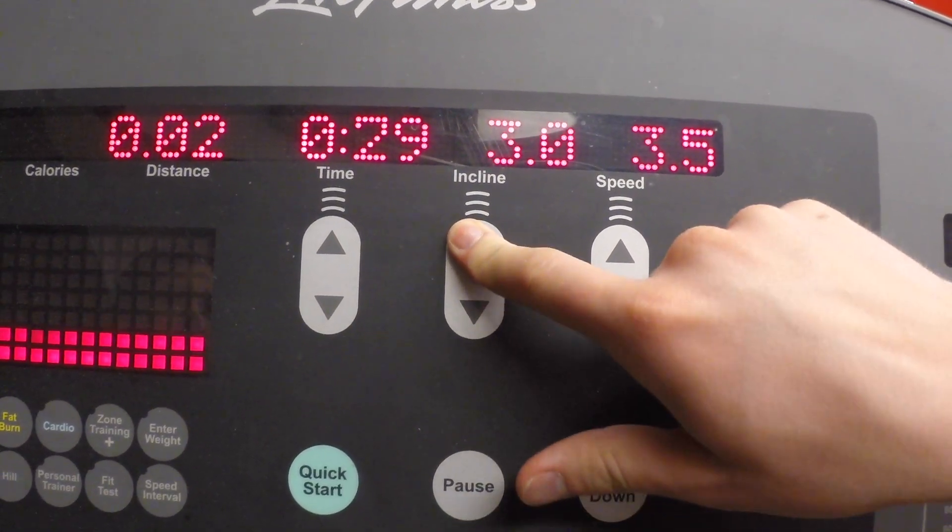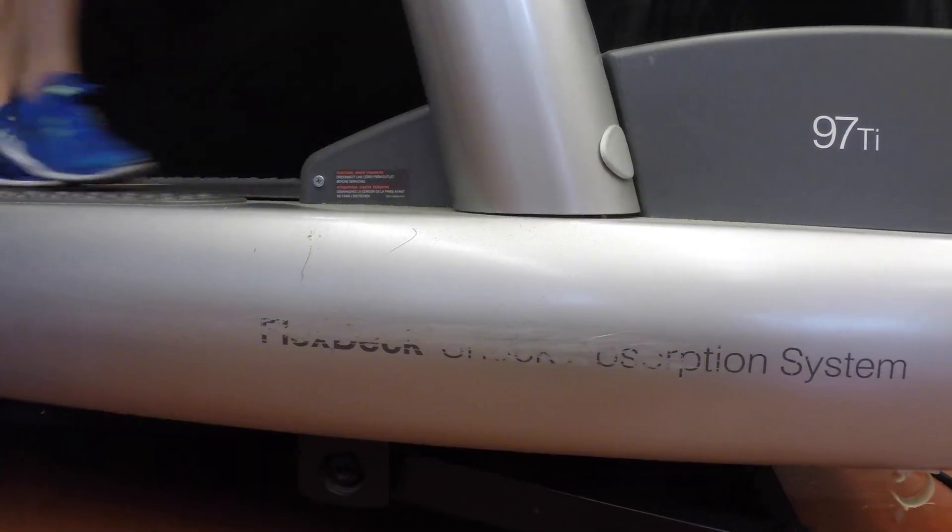Now to continue, increase the grade to 5% and have them walk for another 4 minutes.